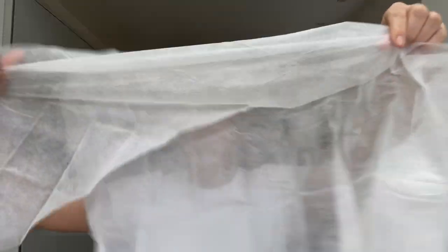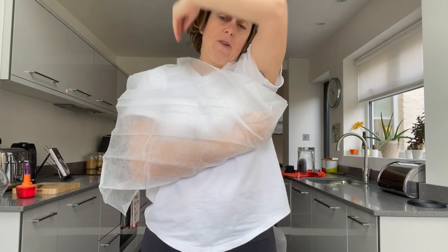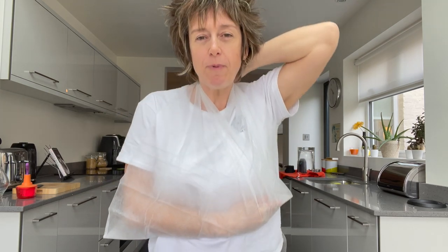Other bandages to consider are triangular bandages, otherwise known as slings. When you open one up you've got a triangular-shaped bandage — some have more cotton-like material. This will be great for making a sling that goes over the shoulder and ties in place for someone who's maybe broken their arm. I'll leave the sling video linked below if you want to see how to do them.